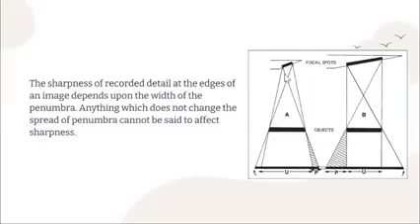So ang rotating anode, gi-compensate niya in order to lessen the heat sa anode and also to provide a sharp image. Okay? Focal spot is the controlling factor for sharpness of recorded detail. So, kung kVp ang controlling factor for image contrast, mAs for optical density, focal spot is the controlling factor for recorded detail.